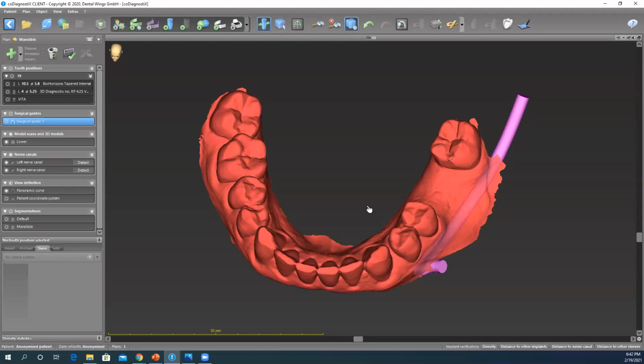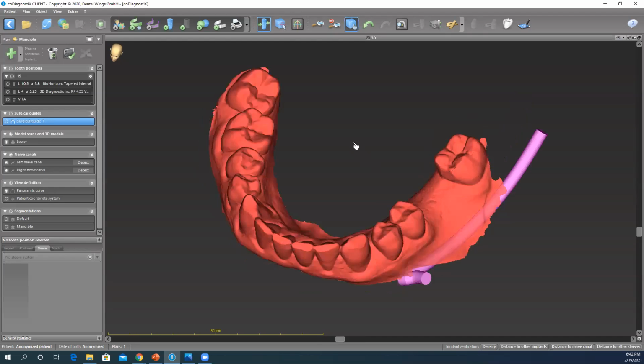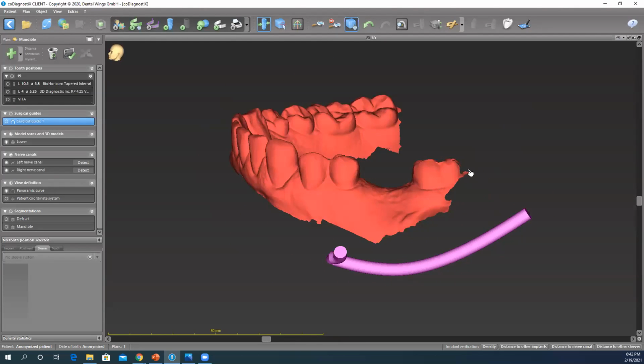I'd like to mention something real quick. For example, if 18 was also missing with 19 and you have a unilateral free-end saddle and you want to place 2 implants there, when taking an impression or an intraoral scan for a unilateral free-end saddle, you need to make sure that your impression or the intraoral scan is distally extending to cover site number 18. We won't be able to fabricate a guide without seeing the soft tissue representation distally. Hope that answers your question as well.